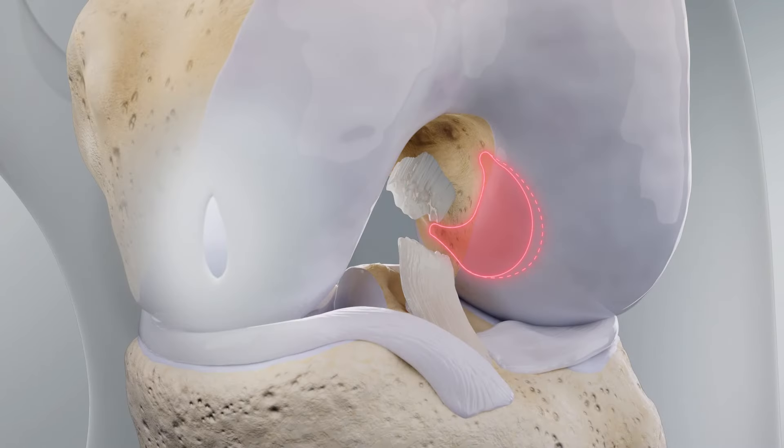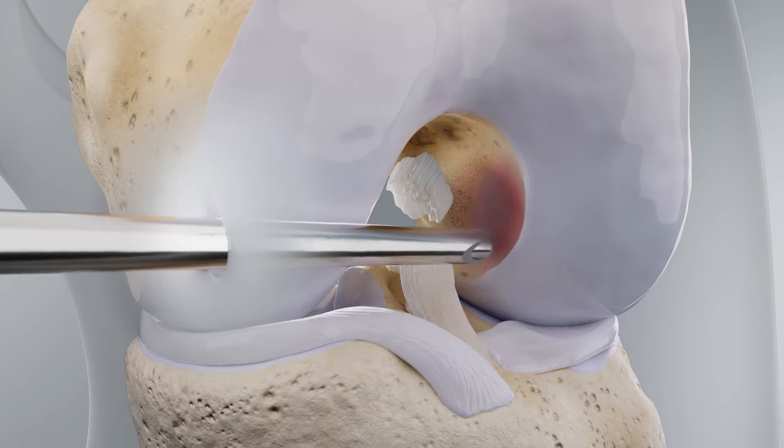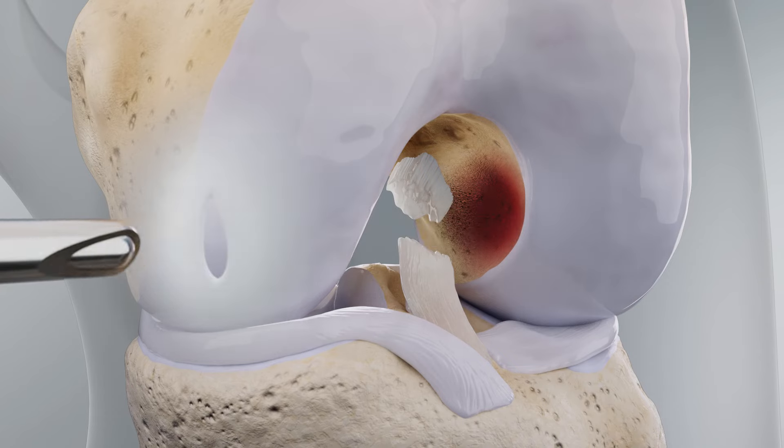Perform a kidney bean-shaped notchplasty, preserving the femoral footprint. Take at least 3 mm anteriorly and 1 mm posteriorly and inferiorly.